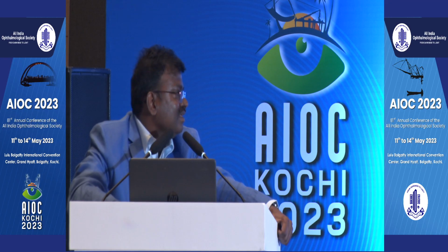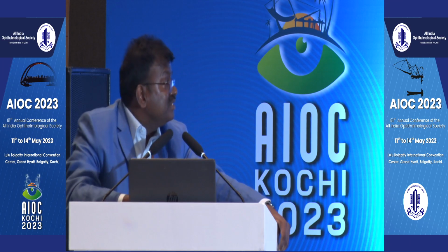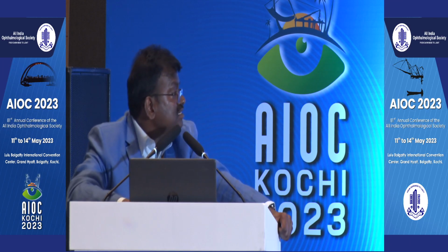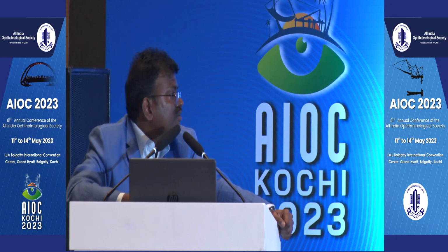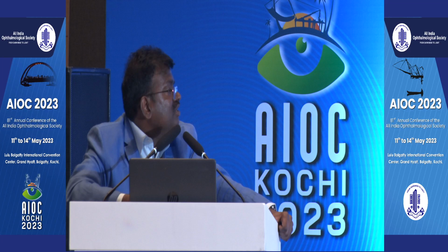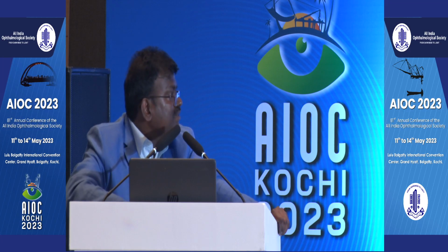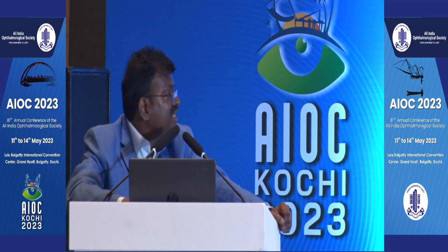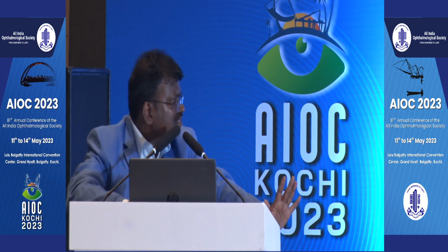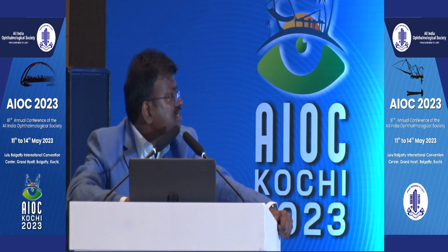And what about the risk of bleeds, choroidal bleeds? That's what I am saying. We have done a lot of cases. Actually, it is like draining subretinal fluid in case of buckle surgery. If we avoid the 3 and 9 o'clock hours, usually it doesn't bleed, number one. And in fact, that is the point of showing the second video, where you can visualize when we are entering, so that you can see it is a smooth procedure. So no bleeding as such happens in these cases.